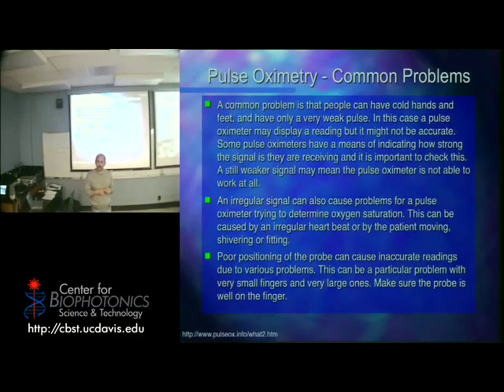Any other possibilities? If your subject is purposely holding the breath just to see if they can make it go down. It's actually pretty hard to affect it, though. Believe it or not, I know many of you guys have tried. It's really hard to do that. Any other thing that might affect? What other reasons might have little blood in the path of the light?